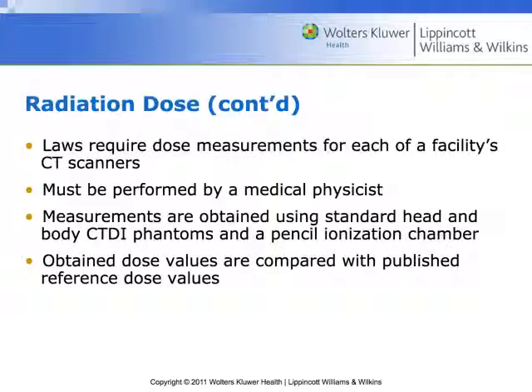And she mentions the pencil ion chamber. They will then compare those doses to published doses that are released every year for that specific vendor and modality and that specific model of that scanner. And the medical physicist community meets every year just to talk about CT dose. They have what's called the CT Dose Summit that they have every single year because this is such a huge part of where people get an exposure to ionizing radiation.